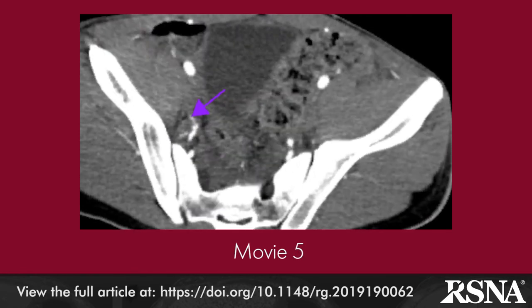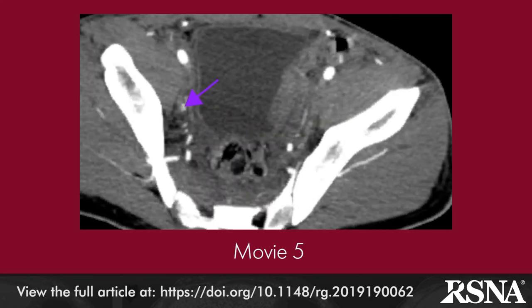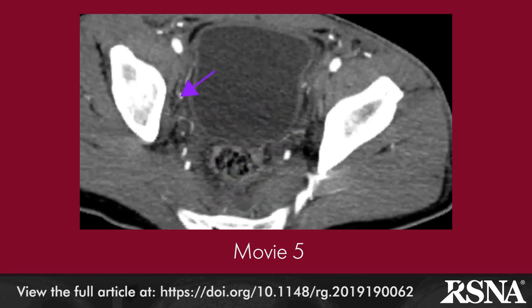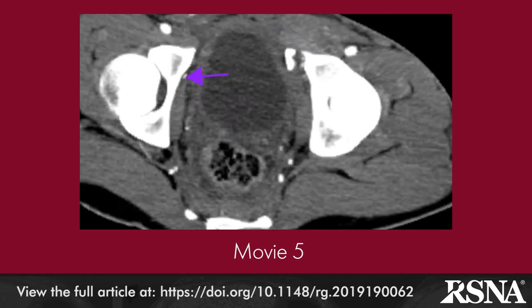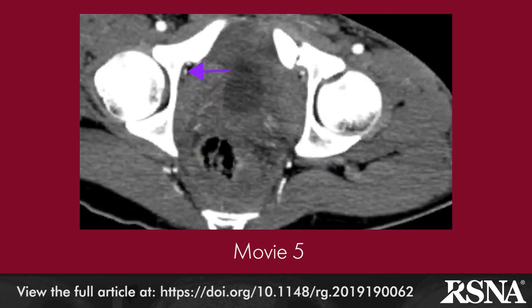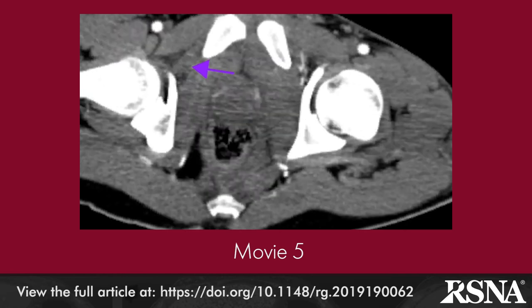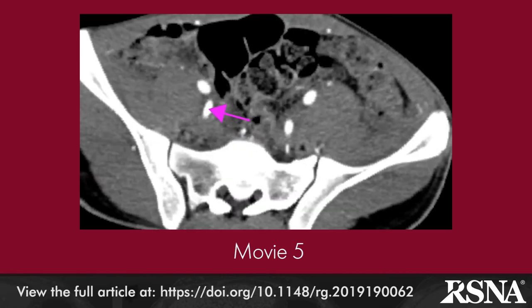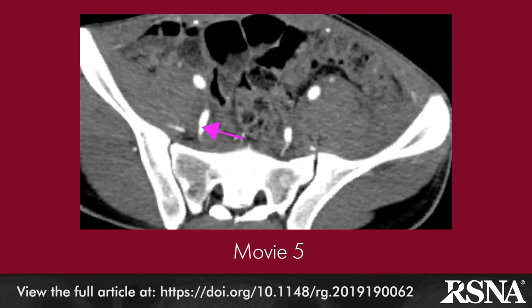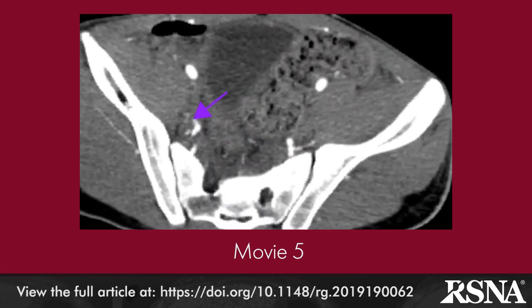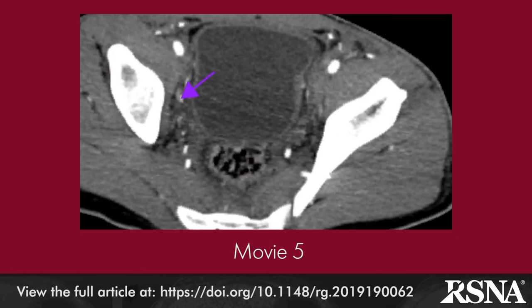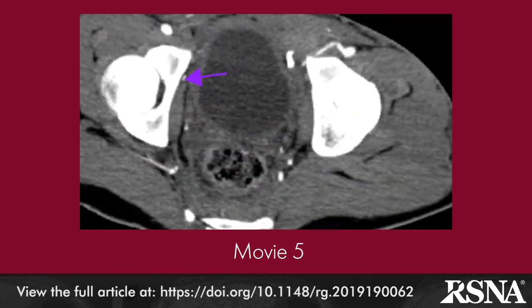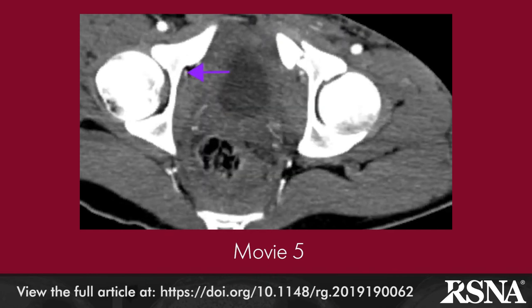Movie 5 covers the anatomy of the obturator artery. An axial maximum intensity projection pelvic CT in the craniocaudal direction in a 31-year-old man shows a colored arrow following the course of the right obturator artery, arising from the anterior division of the internal iliac artery, running in a distinct straight downward and forward trajectory along the pelvic rim, and exiting the pelvis at the upper border of the obturator foramen.